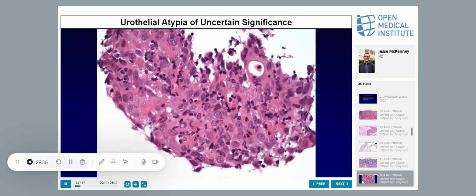Officially, the WHO grading is just on the cytology, it's not on the mitotic figures. But admittedly, if we're borderline between low grade and high grade, and we see a lot of mitotic figures, we'll probably call it high grade. But that's not written down anywhere. But if the general lesion looks more like low grade, but you have mitotic figures in an apical part of it, that's not something that should push it. So if the cytology is really low grade, I would let it go as low grade.